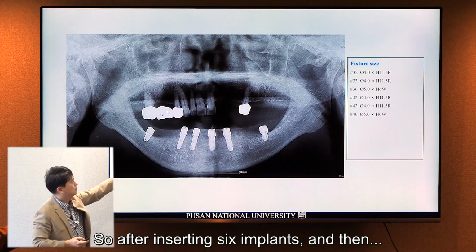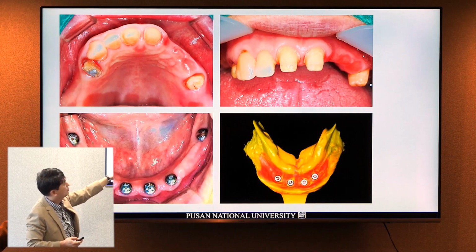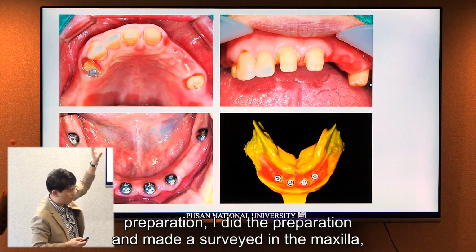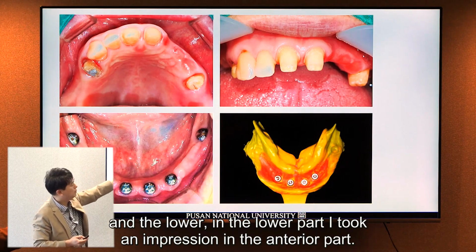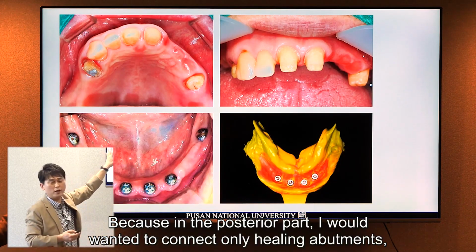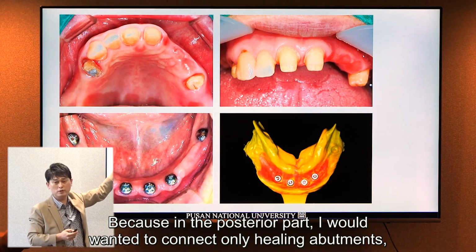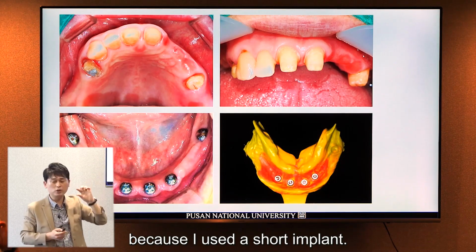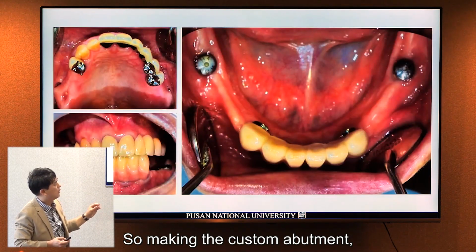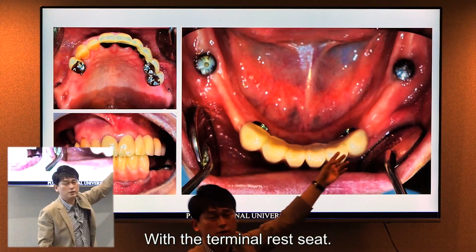After inserting the 6 implants like this, I did the preparation and made the surveyed crown on the upper teeth, the upper maxilla. In the lower part, I took an impression in the anterior part. In the posterior part, I wanted to connect only the healing abutment because I used short implants. So I made the custom abutment and then the surveyed crown like this, with the terminal rest seat.